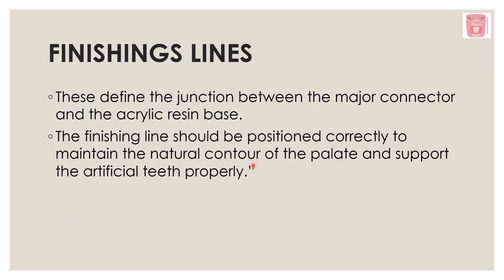Finishing lines. These define the junction between the major connector and the acrylic resin base. The finishing line should be positioned correctly to maintain the natural contours of the palate and support the artificial teeth properly.